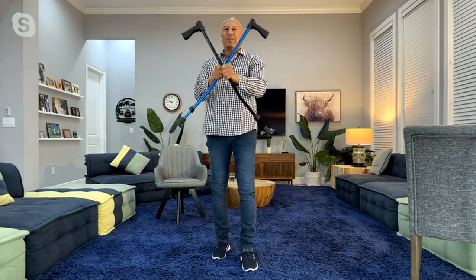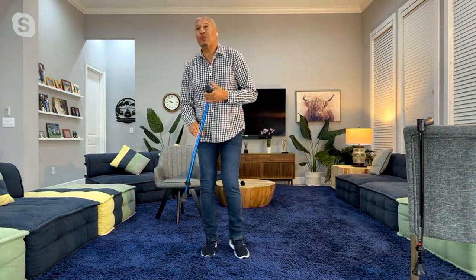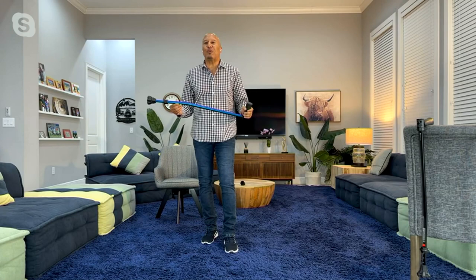Dynamo Cyclone Cane. This is the best cane ever and there is not a cane on the market like it. It comes in black and blue — we have both today. I am the inventor and chief designer, and we have worked with 50 orthopedic surgeons to design this cane. There is not a cane like this anywhere.